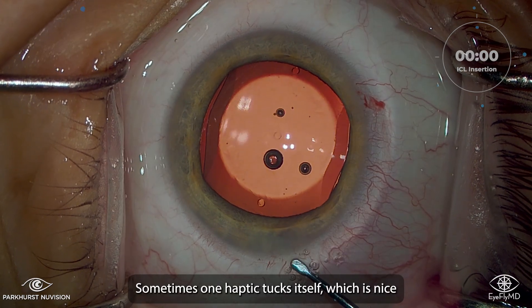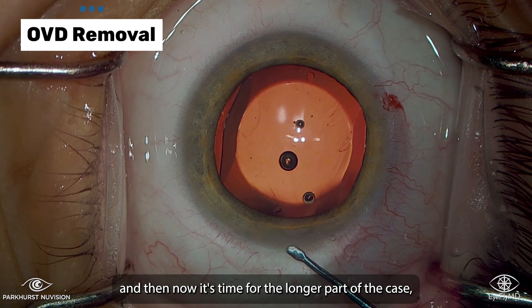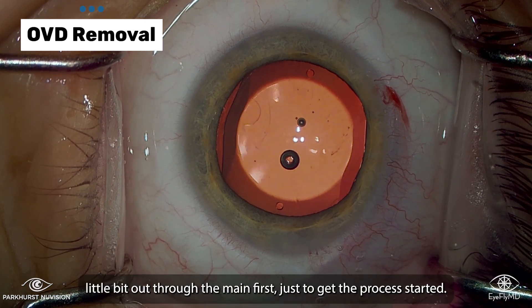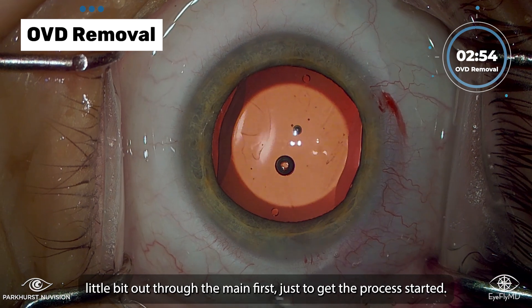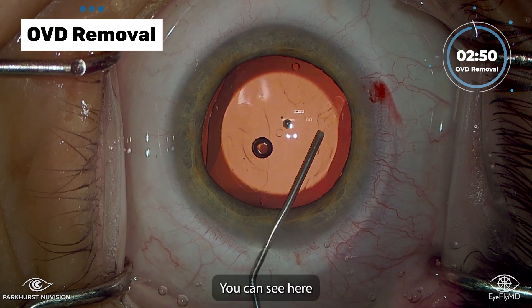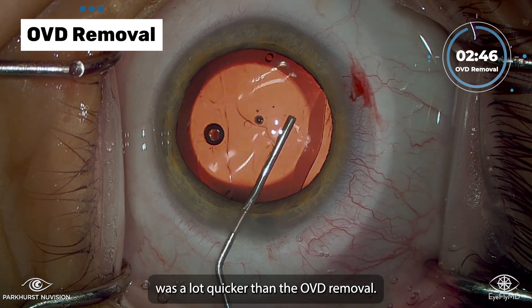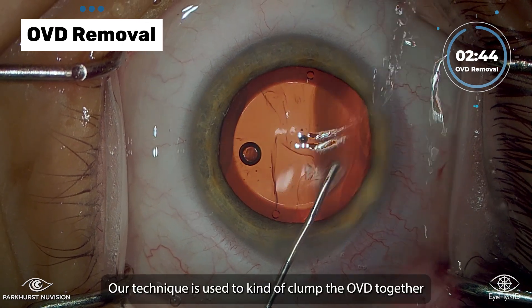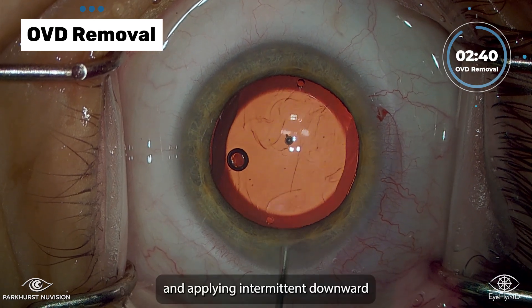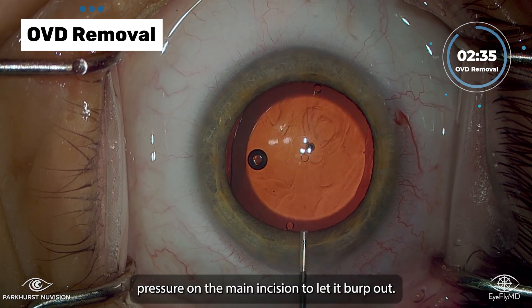Sometimes one haptic tucks itself, which is nice. Now it's time for the longer part of the case, which is actually the OVD removal. We like to let a little bit out through the main first just to get the process started, and a lot of the work really is through the main. The actual ICL insertion was a lot quicker than the OVD removal. Our technique is to use BSS to kind of clump the OVD together, applying intermittent downward pressure on the main incision to let it burp out.